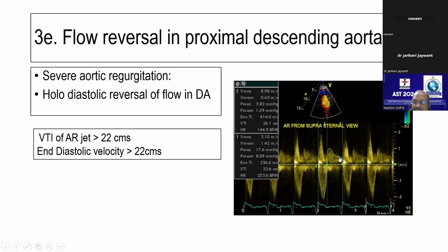You trace this Doppler spectrum pattern. This is the second Doppler spectrum pattern. So I'm tracing this over here. I have to look at the VTI. This is 26 centimeters. But I have not measured this over here. This has to be measured separately, and that is end diastolic.